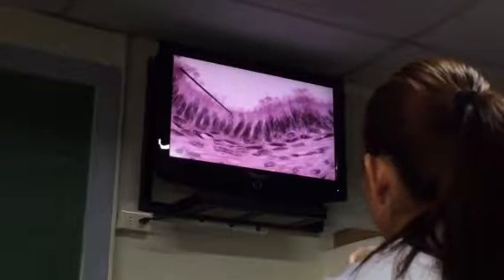And of course we still see spermatozoa within the lumen of your organ. Why are there still spermatozoa? Remember, the vas deferens will transport your sperm cells from the epididymis to the next structure, which is your ejaculatory duct. So these are still sperm cells. This is your lining epithelium with some stereocilia.